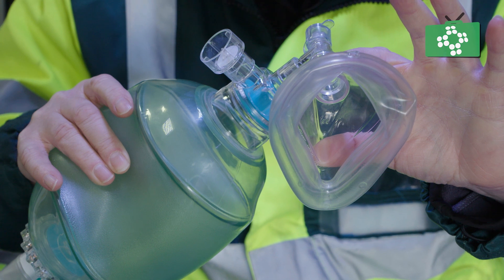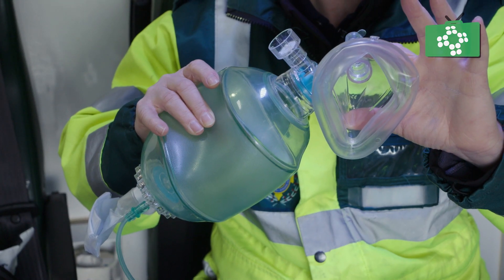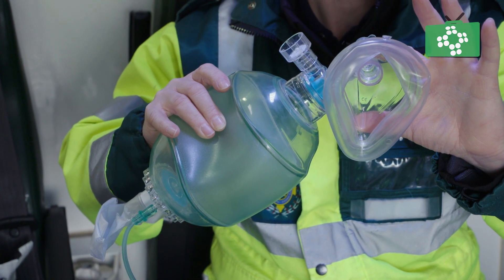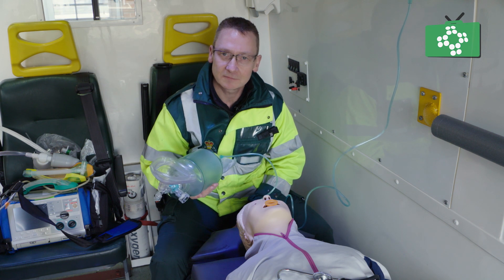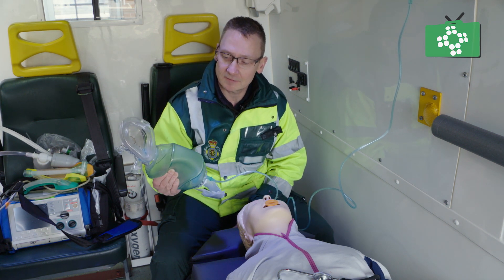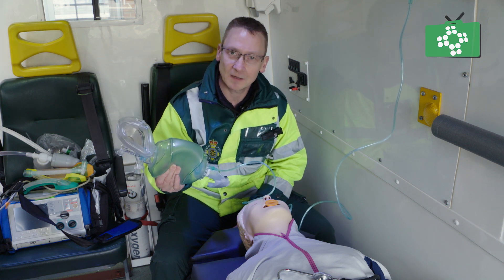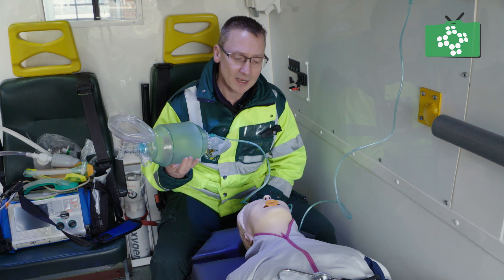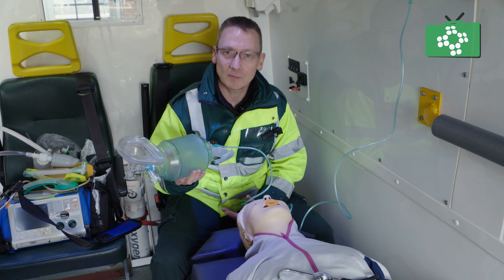A typical bag valve mask has a chamber which holds approximately 1200 mils of air, and this is important to remember — when we ventilate a patient, normal tidal volume is only about 500, so an adequate squeeze of the bag would just be to expel half of the amount of air. When you are ventilating a patient, try to think about how we breathe normally.